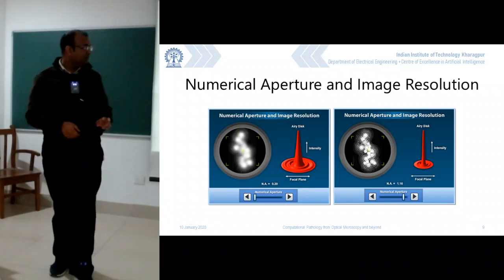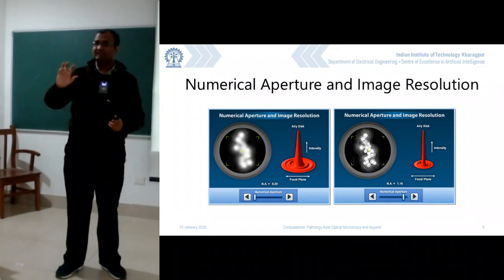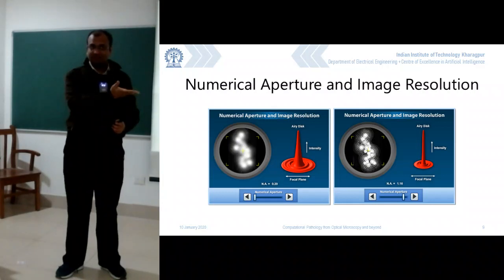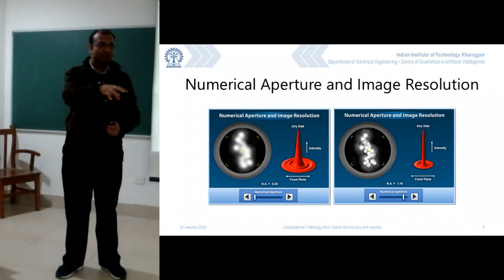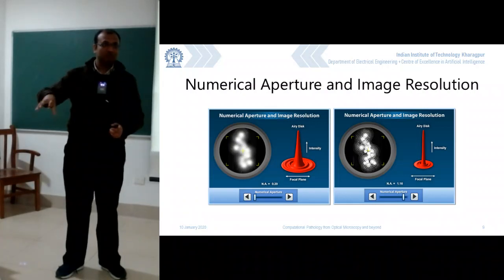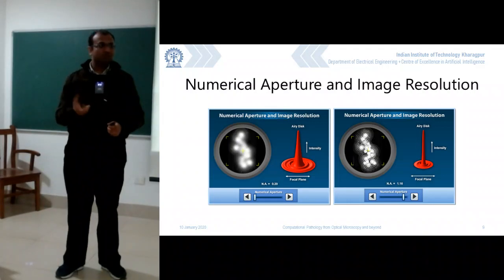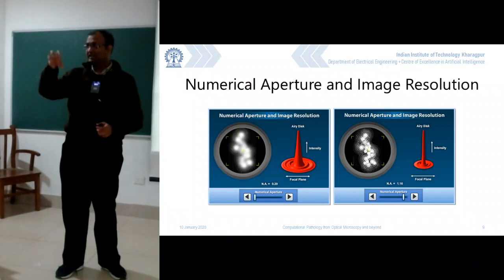And typically how pathologists do it is that they change between these lenses. Yesterday we were doing it on a 10x, which is called a grossing survey. You scan over it very fast and find out which regions have abnormalities and which tissues to look into, and then you change over to 20x or 40x magnification and look into that particular cell or intercellular spaces to find out more details.